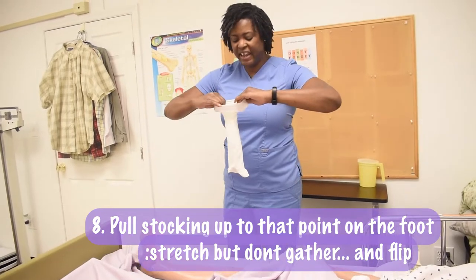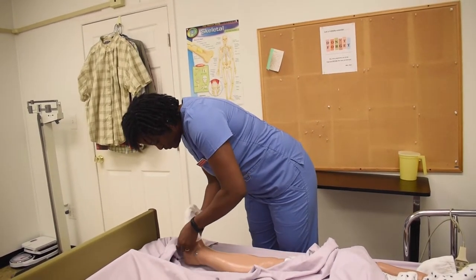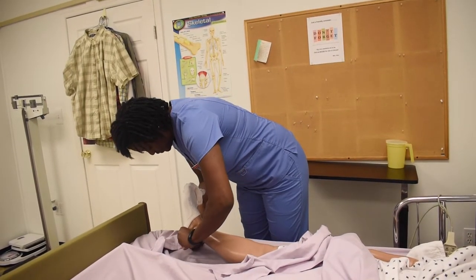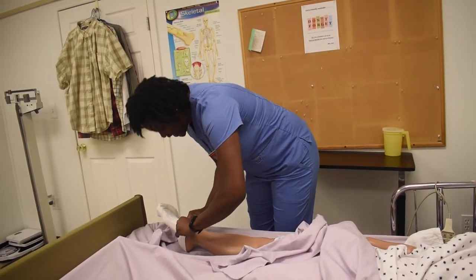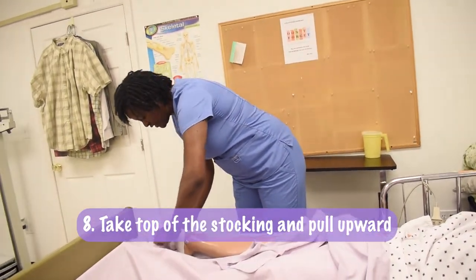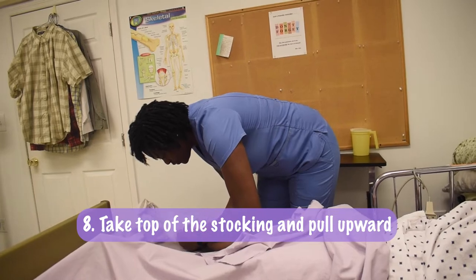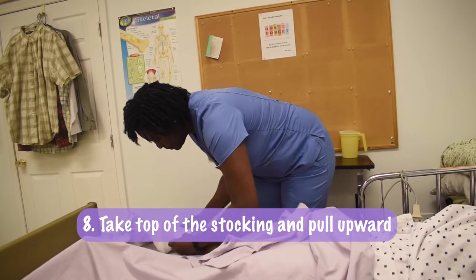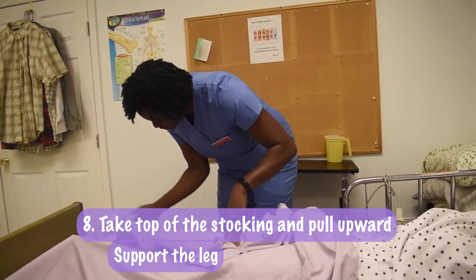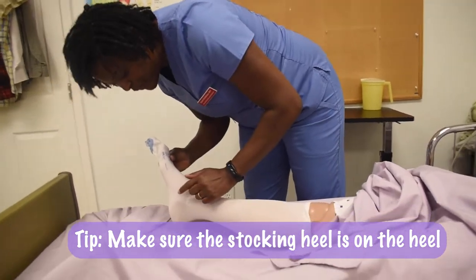Stretch but don't gather and flip. It does take work. I now take this portion and pull that stocking up. Support the leg.